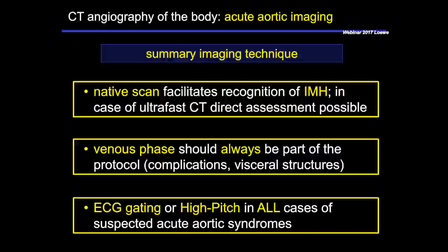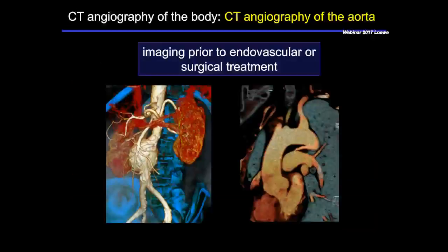What about the role of CT angiography prior to endovascular or surgical treatment? This is really an evolving role, so the number of referrals for this question is continuously increasing, and the questions are a little bit different.